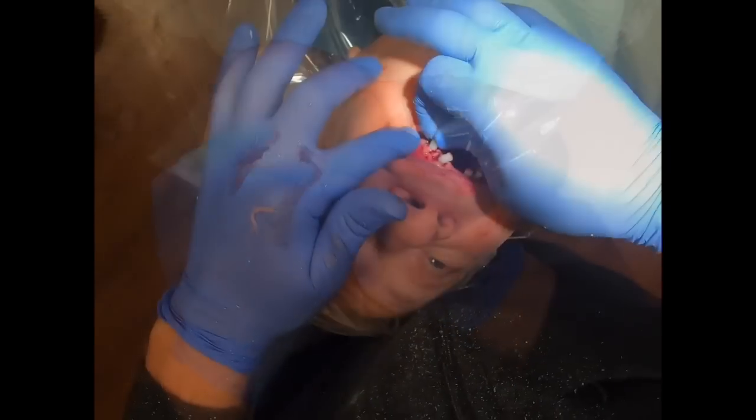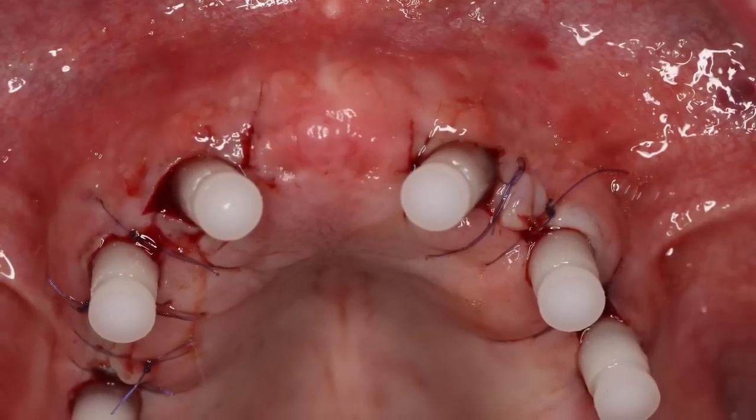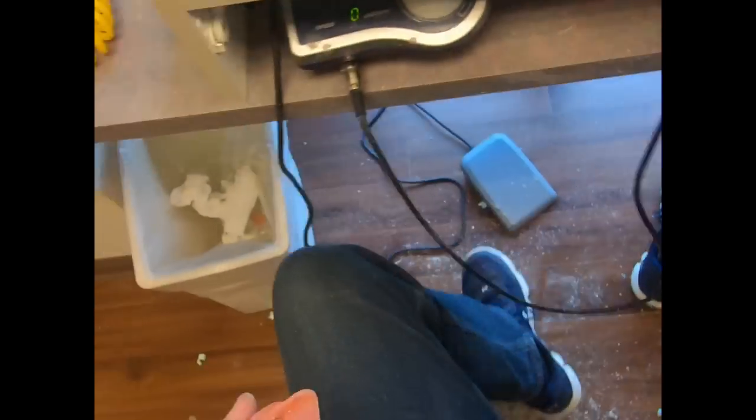Once the acrylic is set, we can just pop the denture off, and then we attach the protective caps onto the threaded posts that are still in the multi-unit abutments. Those will just protect the multi-units from the tissue collapsing while we're in the laboratory.